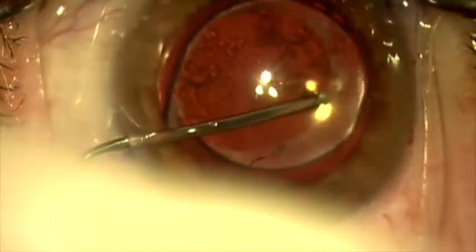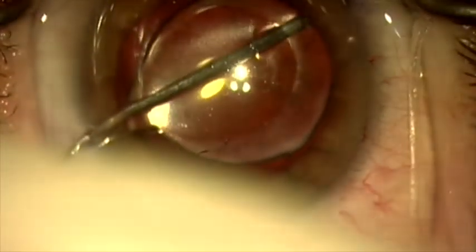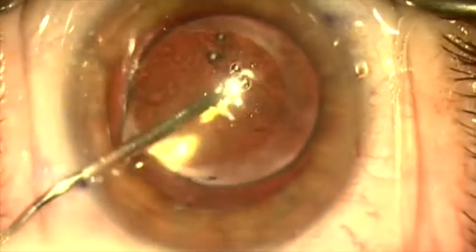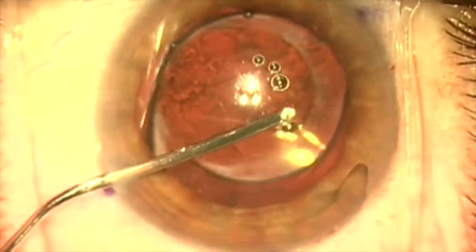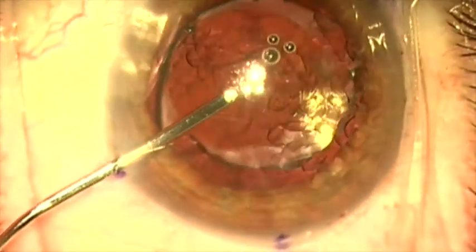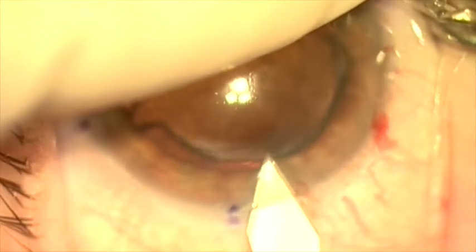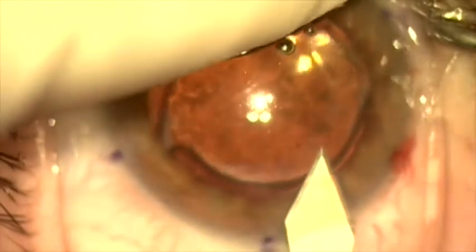Here we're using dispersive viscoelastic on a 26 gauge LASIK cannula to initiate the reopening of the capsular bag. This lens is pretty socked in place — it's been in the eye for quite a while. We reopen the bag and put viscoelastic in the anterior chamber to firm the eye up, protect the cornea, and make our main incision with the keratome.